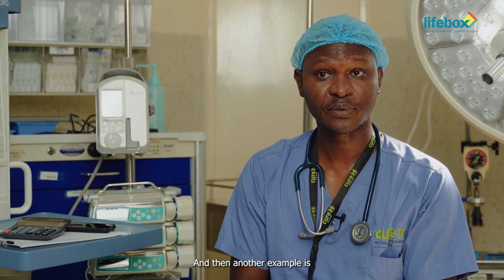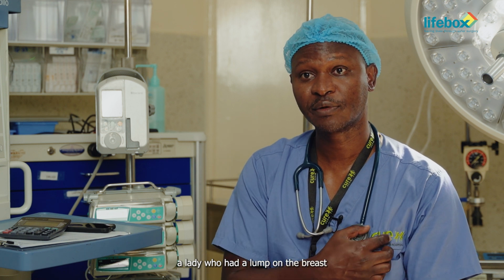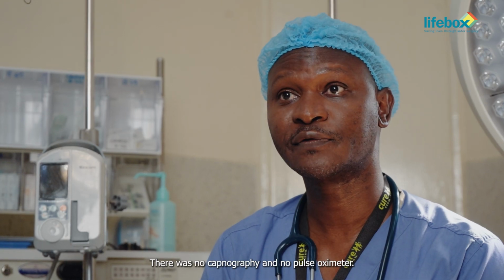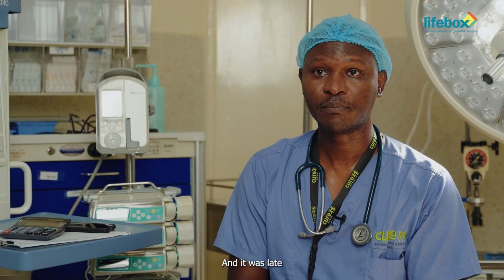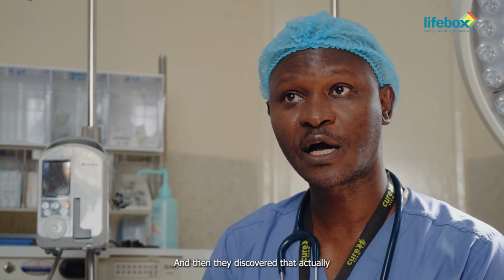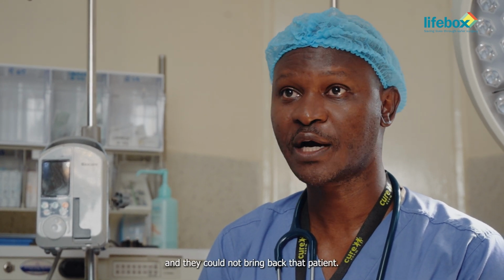And then another example is a lady who had a lump on the breast and she came for surgery. And unfortunately, the anesthetist in that room did an esophageal intubation. There was no capnography and no pulse oximeter. And it was late when the surgeon discovered that blood was really dark. And then they discovered that actually that patient had cardiac arrest and they could not bring back that patient.